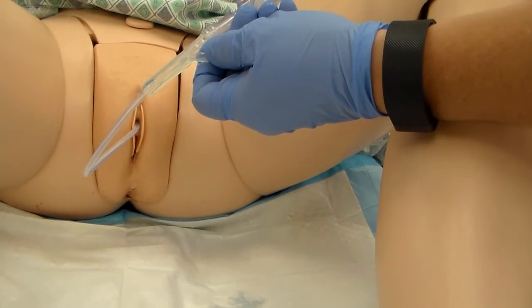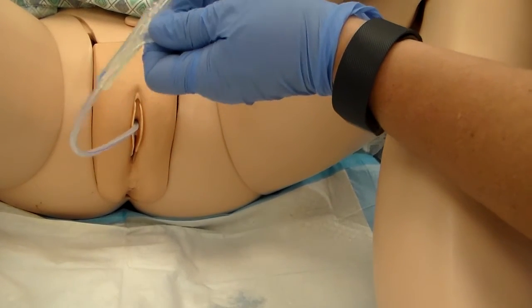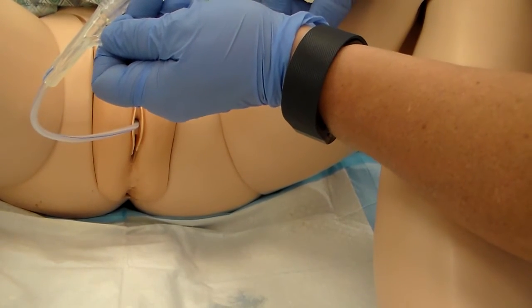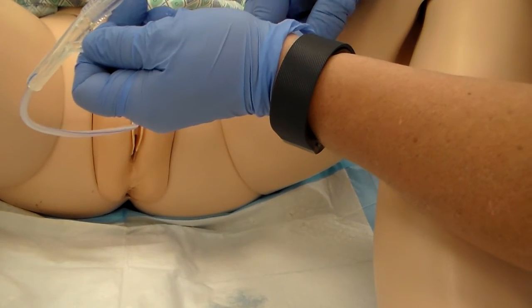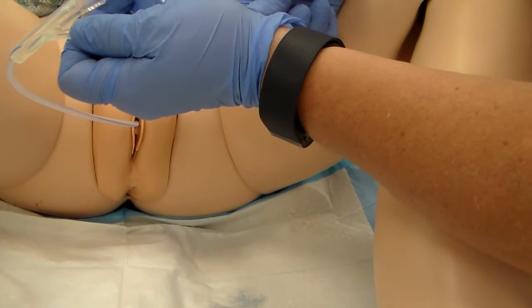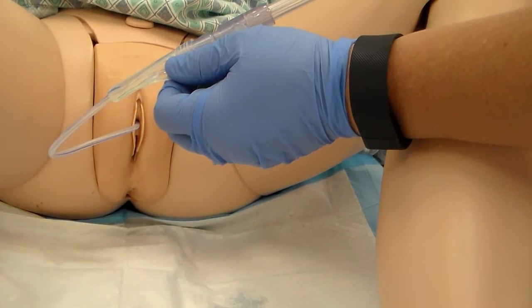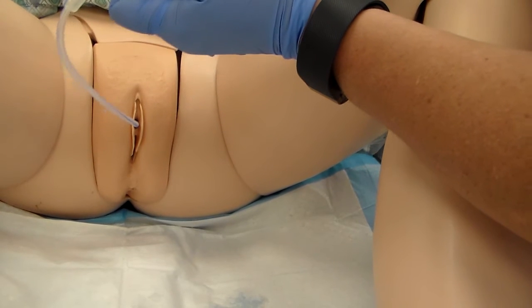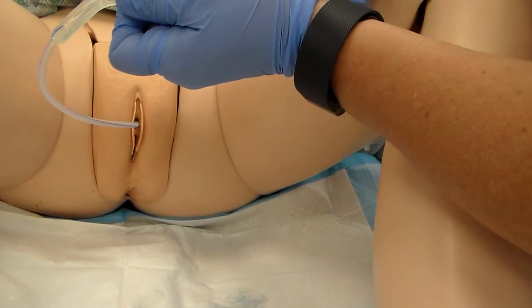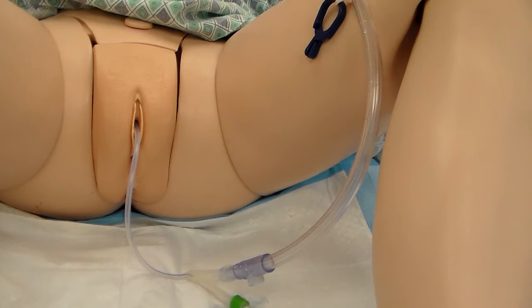This isn't as easy as it looks with this mannequin, sorry. See why I put the chucks and why I wear gloves, right? Okay, we're getting there. Let's look. We've only got about 9 milliliters, so let's try to draw off a little bit more. Alright, got 10 milliliters of saline out of there, okay?